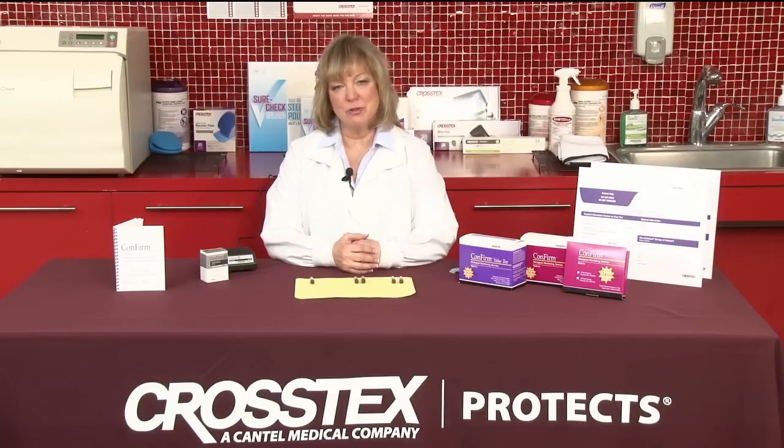Hi, I'm Leanne Kiefer. I'm a dental hygienist and I'm also Director of Education for Crosstex. We have a number of ways that we can monitor the process that we're doing, including physical and chemical, but I really want to focus on the options that we have for biological monitoring.